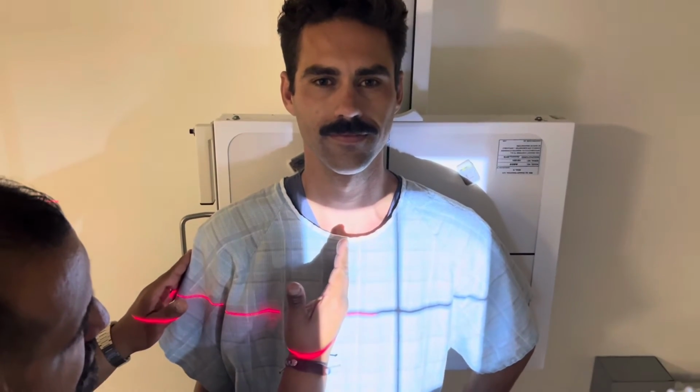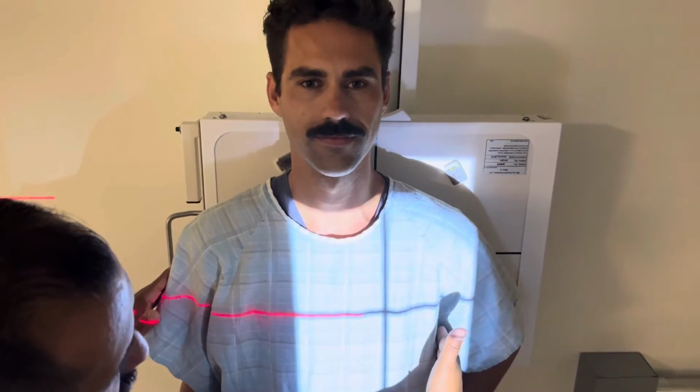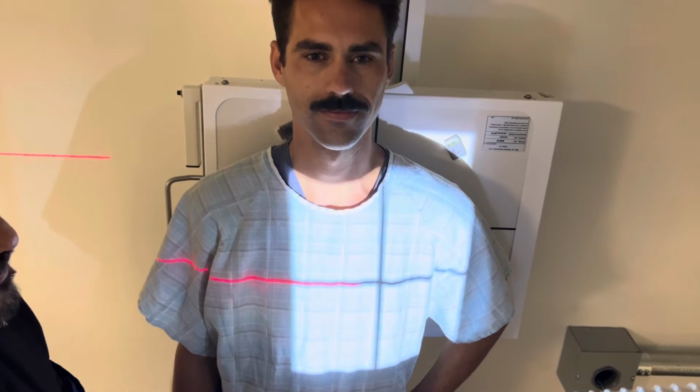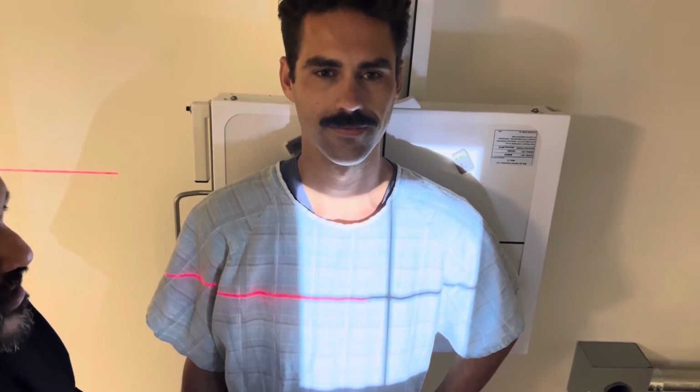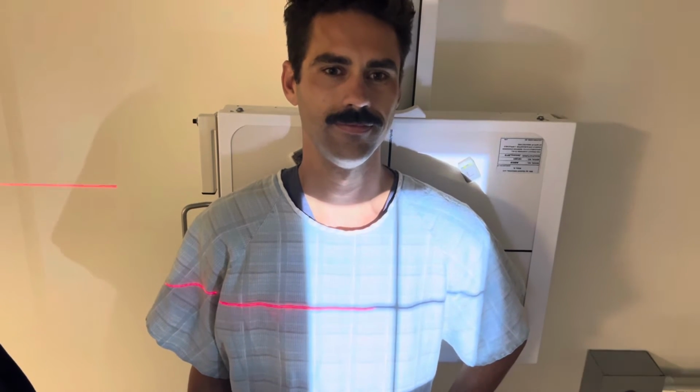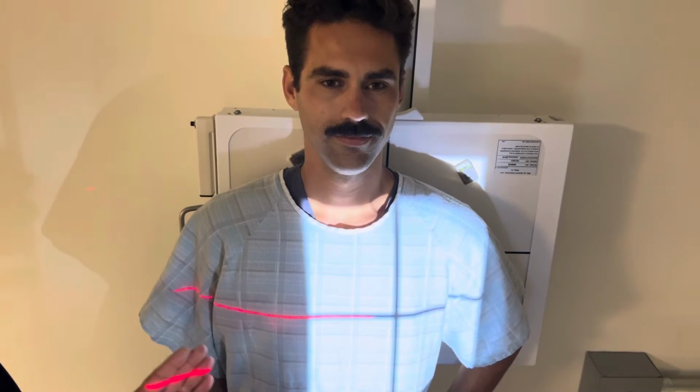So again, you're trying to get the site of interest closest to the board. So I just kind of abducted the arm a little bit. Again, here is his sternum. His axillary rib border is here. So we want to go in between those two points. We're at the level of T7. Again, this is above diaphragm for the left posterior rib injury. So now I'm going to have the technique set at 10 mAs at 74 kV. I'm going to have you breathe in and let it out. Breathe in again and hold it again. Keep it just like that.